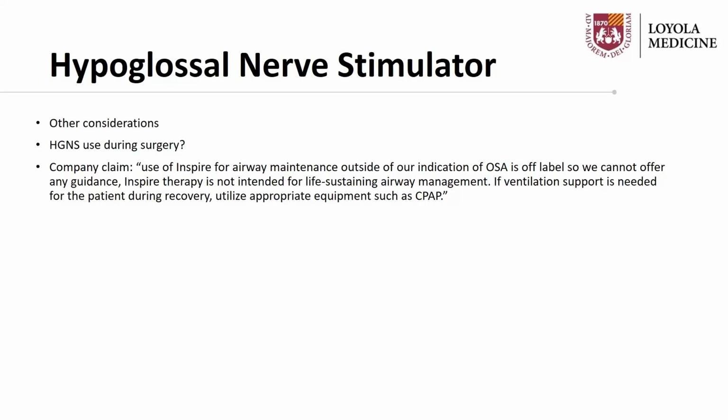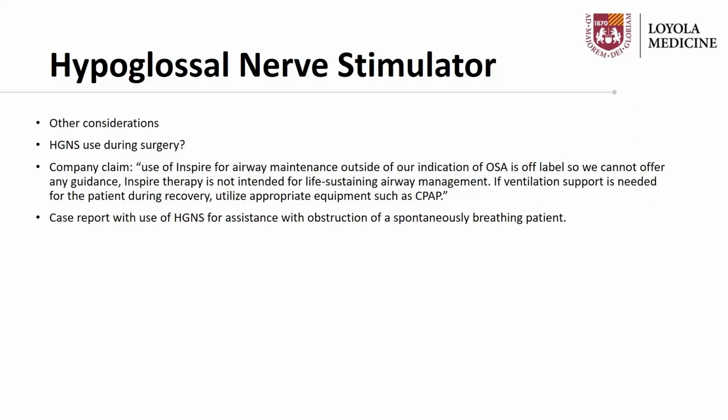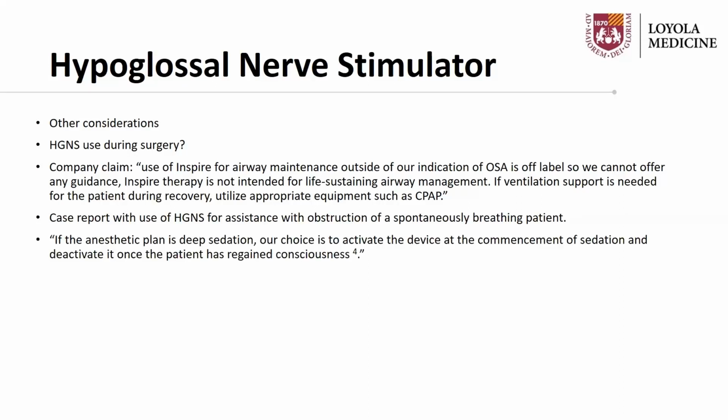Therefore, if ventilation support is needed for the patient during recovery, you have to utilize gold standard equipment such as CPAP, BiPAP, etc. However, I was able to find a case report in which the authors described using Inspire during sedation cases. They write that if the anesthetic is planned as deep sedation or MAC, their choice is to activate the device at the commencement of sedation and to deactivate it once the patient has again regained consciousness.